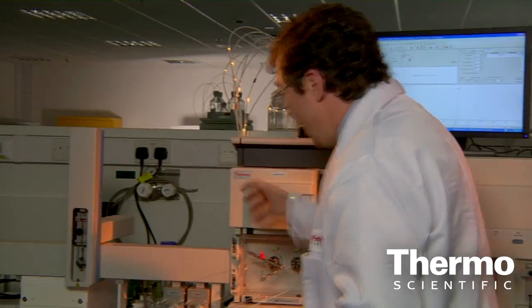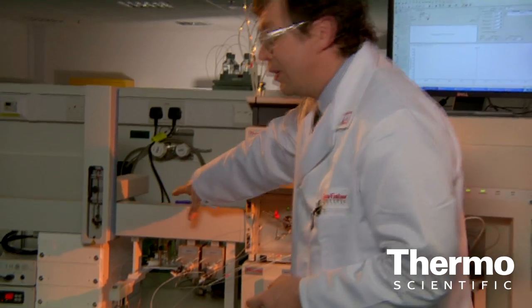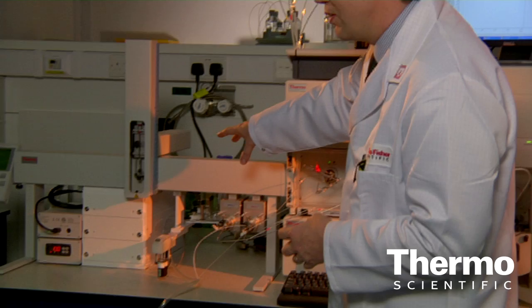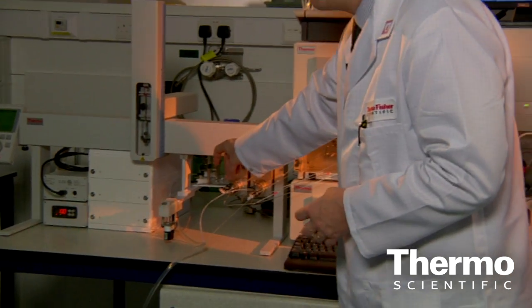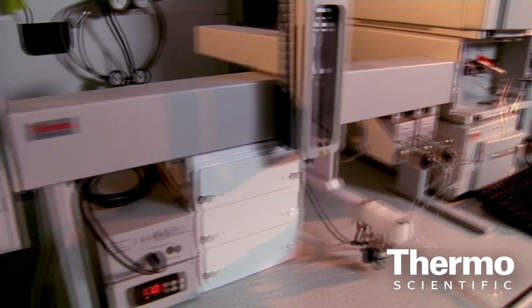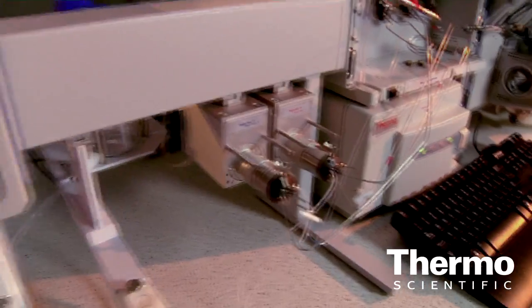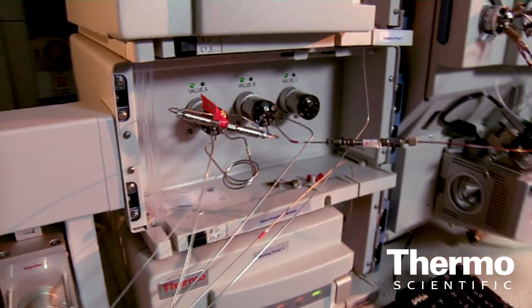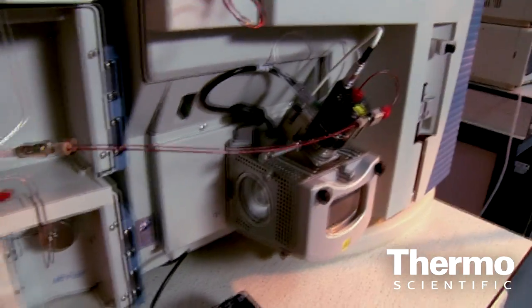So what actually happens is that you take a standard autosampler, this is a modified CTC, and you inject the neat plasma or neat biological fluid into this section here and then it goes through a selection of valves onto the turbo flow column.